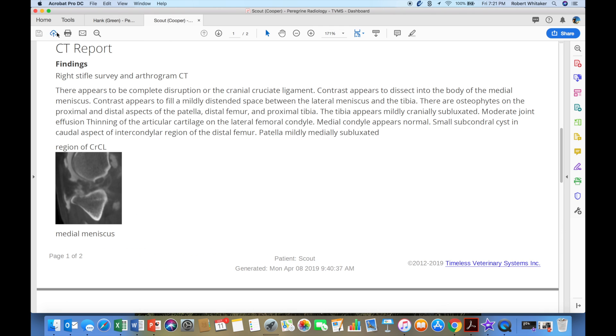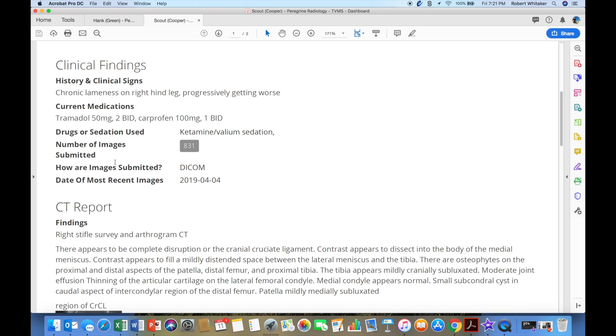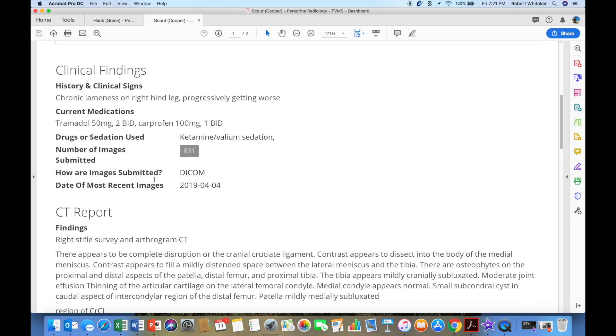If we look at another patient named Scout, he had the appropriate amount of contrast delivered into the joint space. History is a little shorter here: chronic lameness on the right hind leg, progressively getting worse. They also only submitted images of that right hind leg. My recommendation is when we do arthrograms, we do both knees. Sometimes we may only want to do contrast in the one that is lame, but I do recommend contrast in both so we can get a good comparison, plus a pre-contrast scan of those knees.